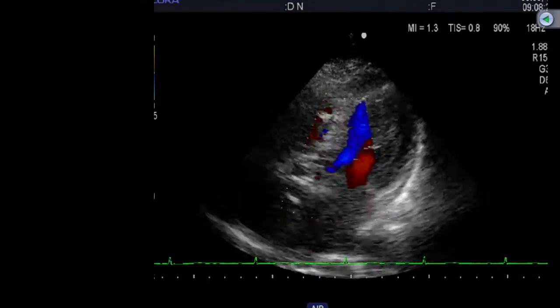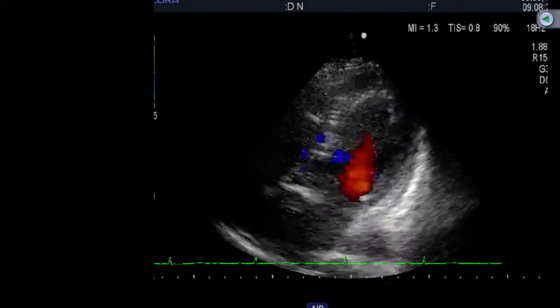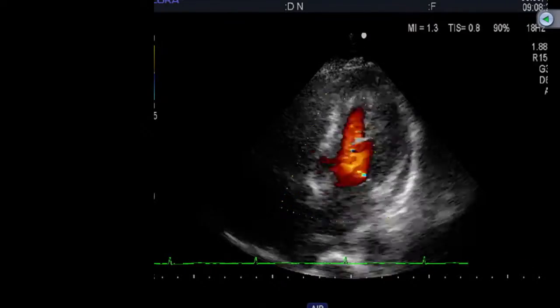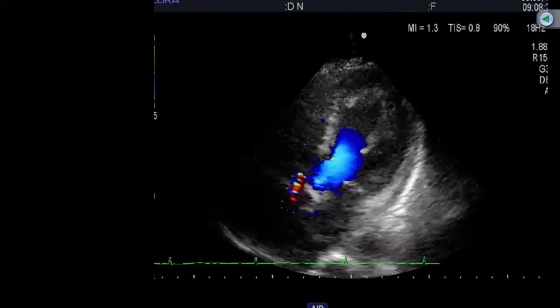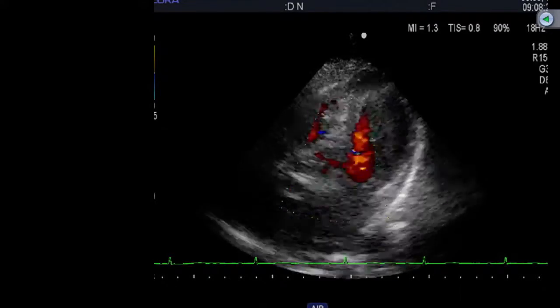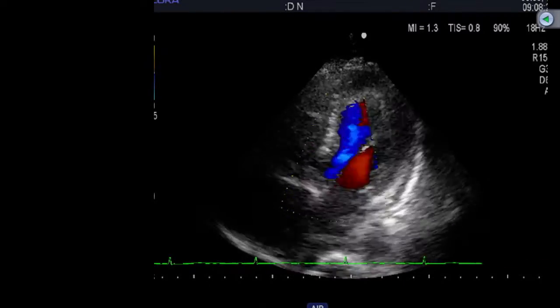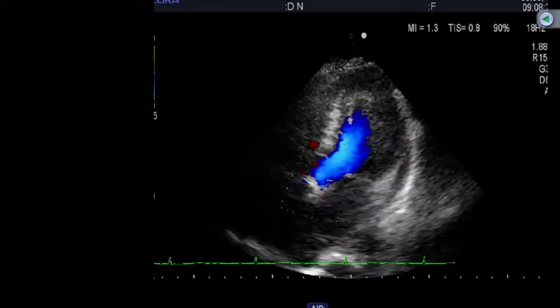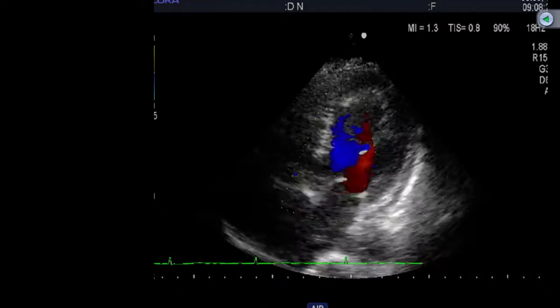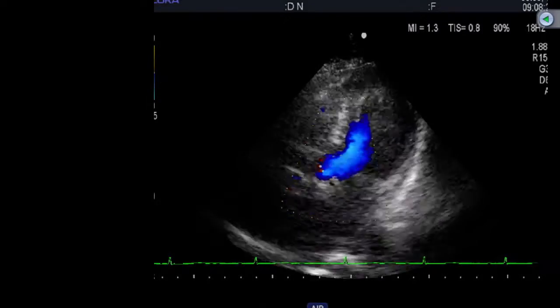You can see here, the most critical part is to get a good transthoracic baseline. The baseline assessment is showing, you can see here the loop is playing with the color. The patient has preserved LV function. There's a minimal amount of pericardial effusion. Recording a baseline pericardial effusion is important, because during the procedure, if there is any interval change, that has to be reported.